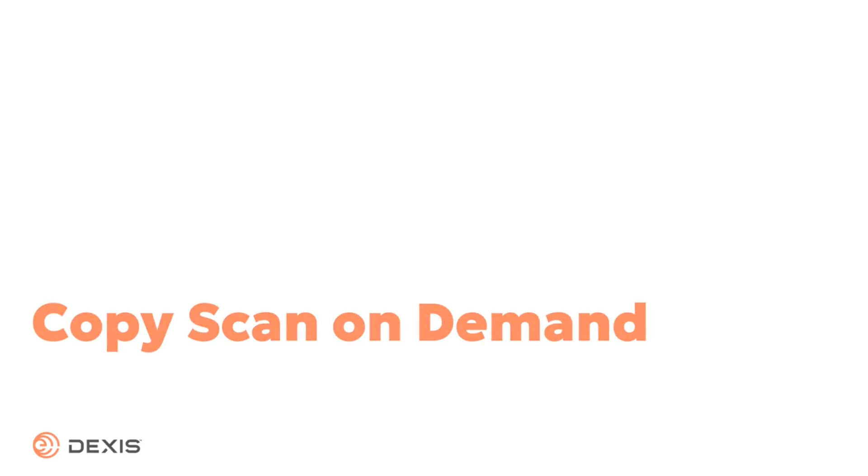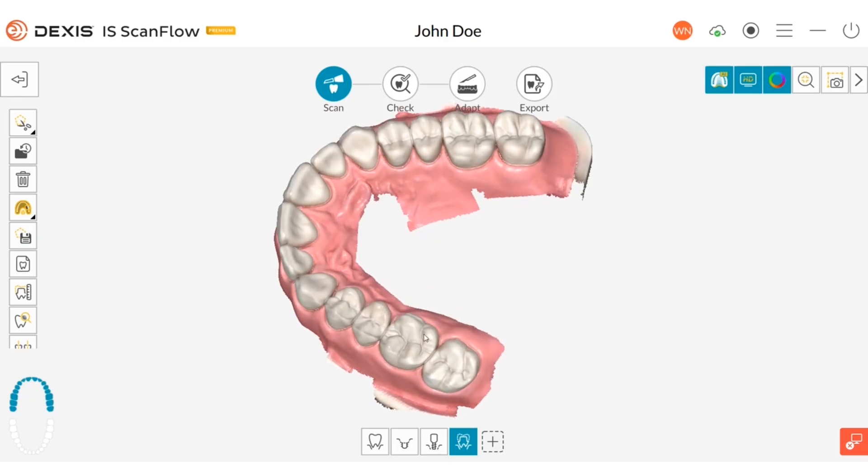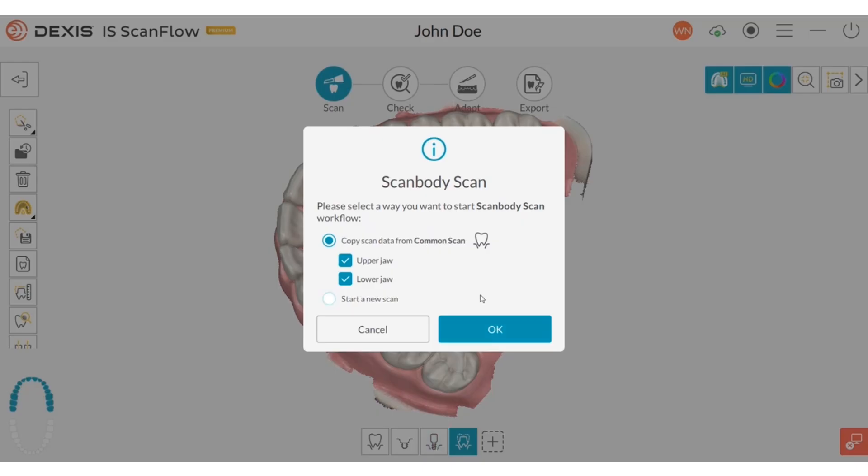Copy Scan On Demand. In implant and denture workflows, copy only the arch and treatment to save the copy time, refinement time, disk space and memory.